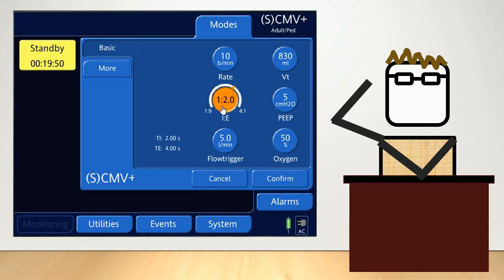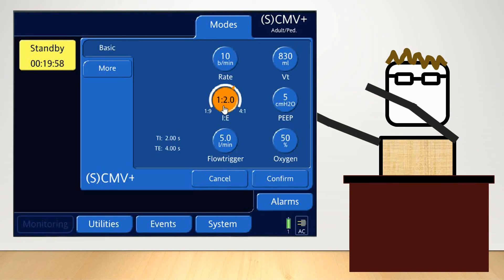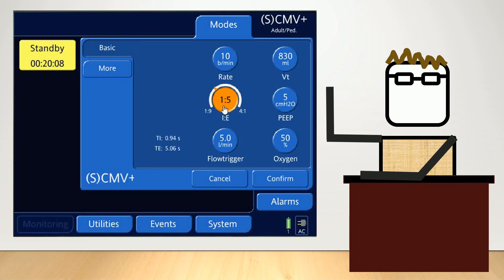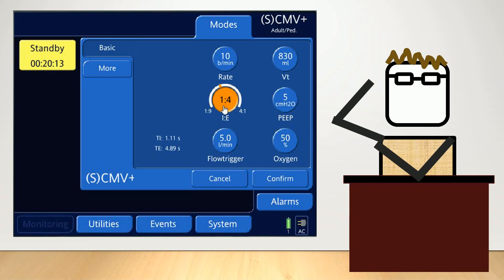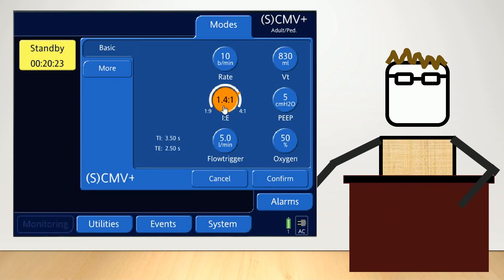In some circumstances, you're going to want to adjust the IE ratio depending on the patient's characteristics — such as if they have obstructive airways, COPD, or asthma. You may need to extend their expiratory time to give them more time to exhale. Or if they have problems with lung recruitment and you want to maximize inspiration time, you may want to set their IE ratio closer to 1:1 or even invert the ratio if appropriate.